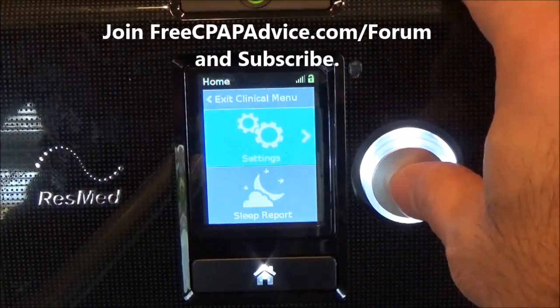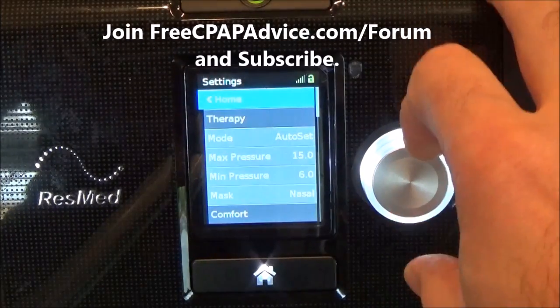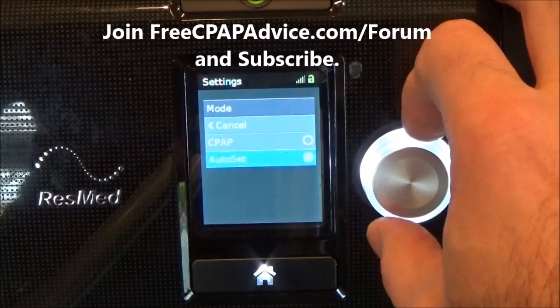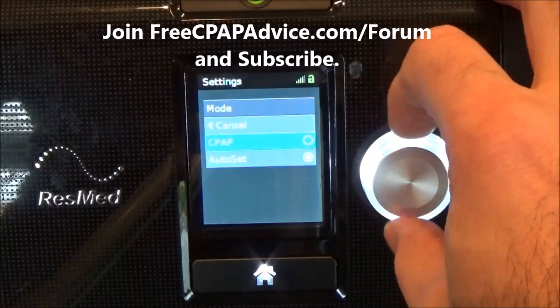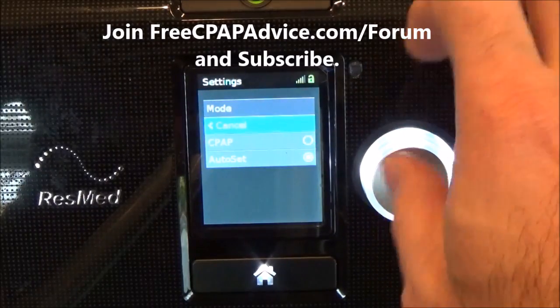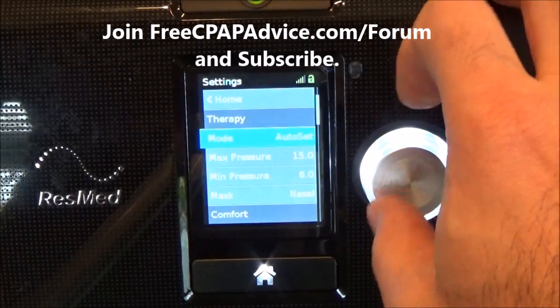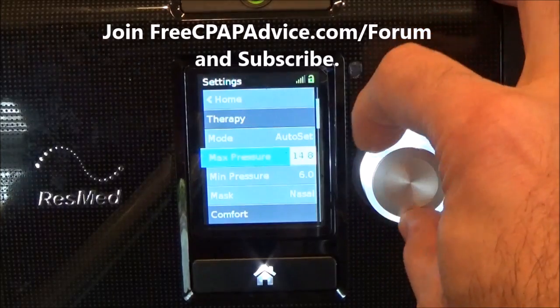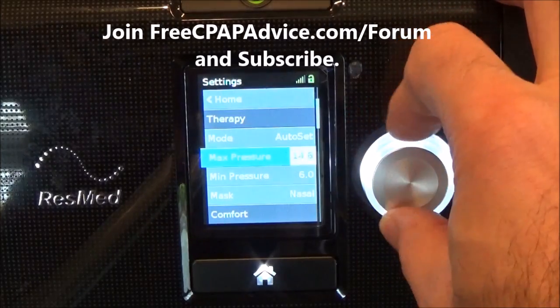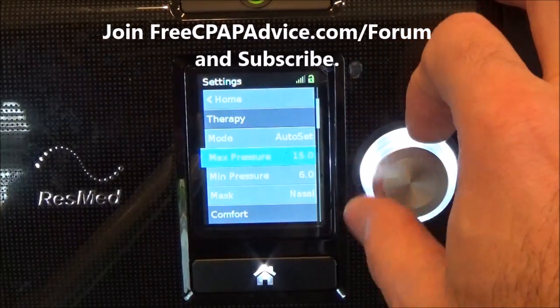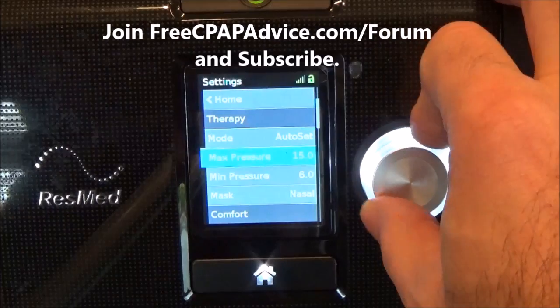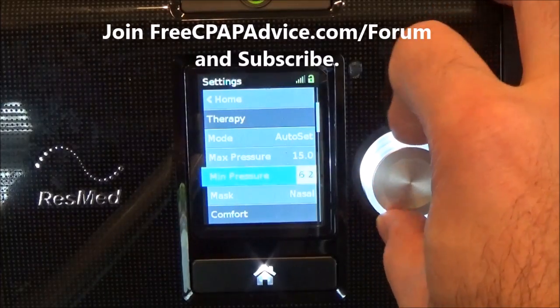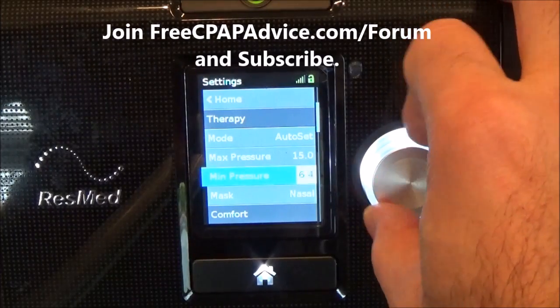We're going to push in on settings. You can go to mode — Auto Set — or you can switch it to CPAP if you want. We're not going to right now, so we'll cancel that. You can change the max pressure by selecting it and twisting. Selecting for min pressure and twisting.